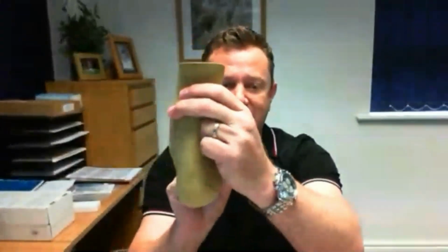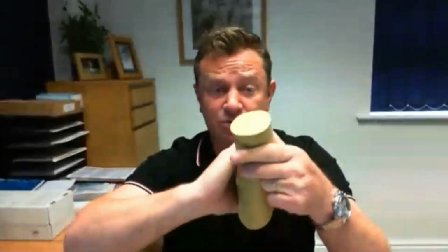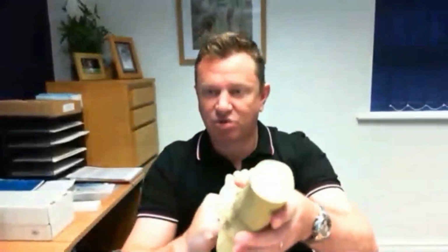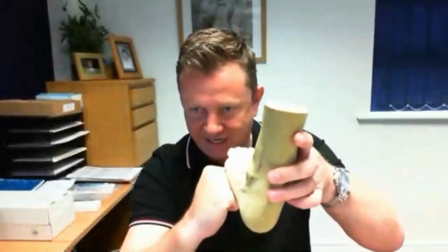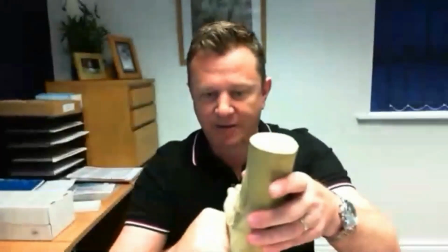If I've got a rotation issue, a supinating or a pronating foot, I will try to overcorrect it rather than hold it midline. So if you've got a foot which is supinating all the time and you try to hold a supinated foot in an orthosis, then some comments in the chat, you should always use a lateral T-strap. I would argue, no, you shouldn't. I would be arguing you need to be generating lateral forces through the midfoot and the hindfoot, which is what the peronei should be doing, to try to give that foot intrinsic rotational equilibrium or stability, to try to make it harder for spastic muscles to work and to create stability.